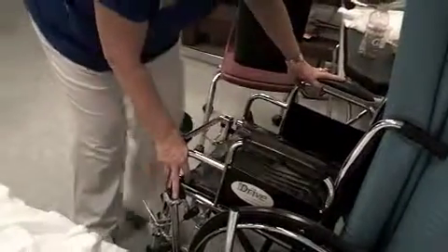They have to raise these footrests to get them up out of the way. Since this has a swing leg, I'm going to take advantage of that and swing it out of the way. I don't have to — it didn't say that — but to make this skill go better, I'm going to do that. But I don't want to get it too far from the bed because I want to get the kudo points for being alongside the bed. I've got my chair locked and my bed locked. If you teach them to keep these two things in their brain — lock bed, lock chair — if they hook those together in their brain, they'll remember to get either one of them.